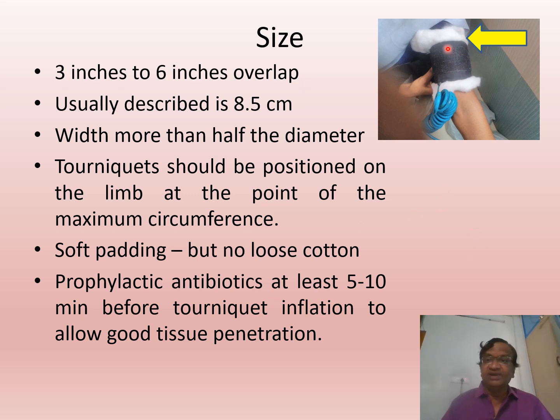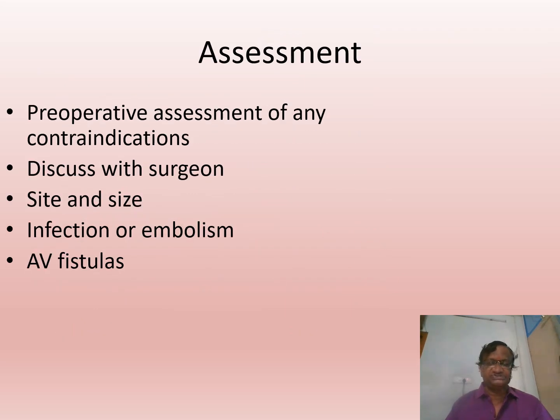And we should not give antibiotics after the tourniquet, because if you give it in the other limb IV and the tourniquet is applied to the injured limb, it will not go only. So all drugs should be given 5 to 10 minutes prior to the tourniquet.